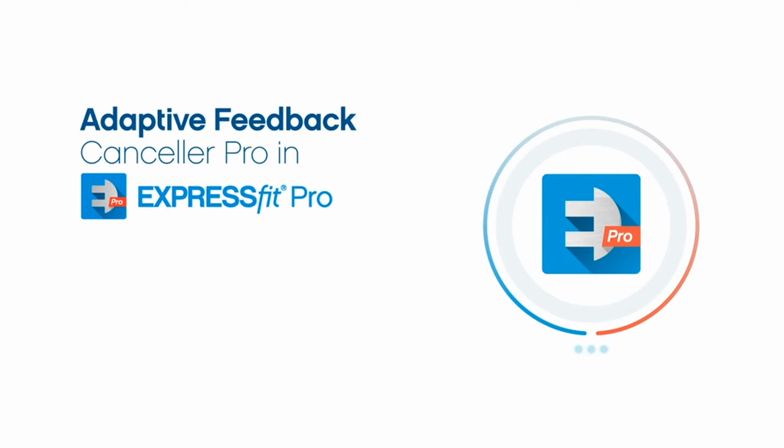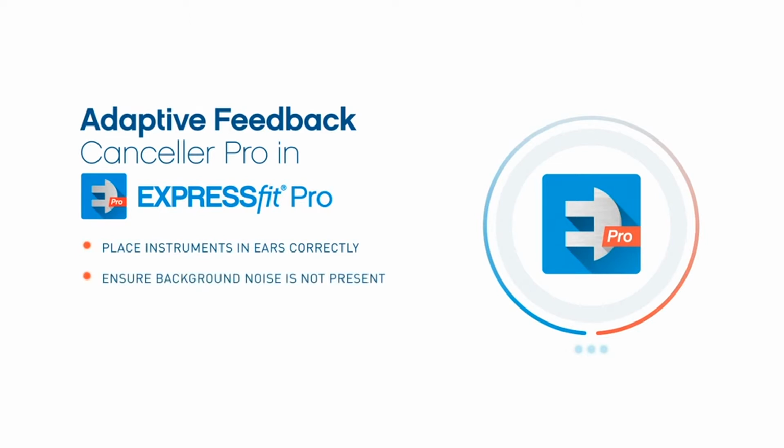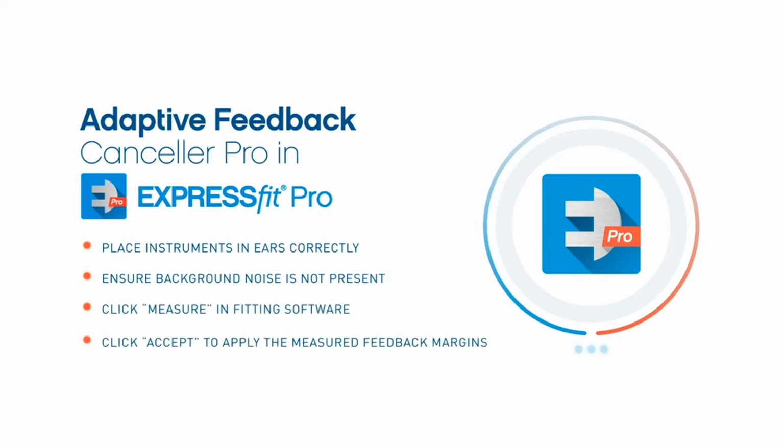AFC Pro is easy to use in the fitting software. First, place the hearing instruments in the client's ears correctly and ensure background noise is not present. Click Measure to run the measurements, then choose Accept to apply the measured feedback margins.